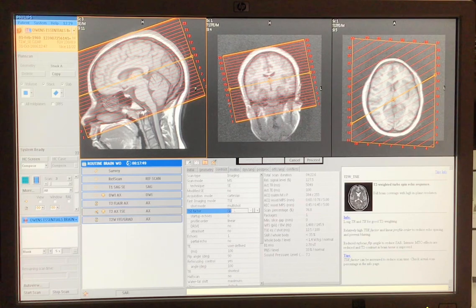So, I'm going to give you ranges. A turbo factor for a T1, you want to be from 2 to 4. For a T2, you basically just want that to be probably like 15 or higher. So for this particular practical, if you have a 15, that's fine.